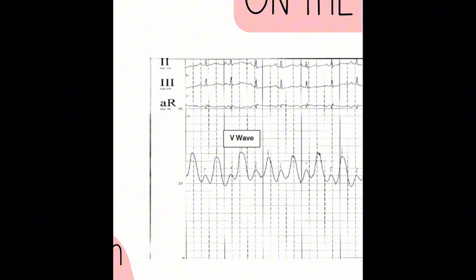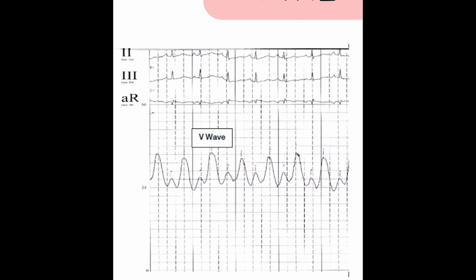This one did indicate it for you, kind of, but if I said click on the V wave, you need to know this is PQRST. PQRST. We talked about this again in the basic waveforms PowerPoint if you need to go back.